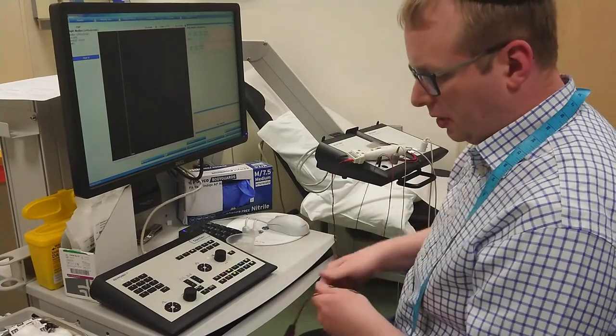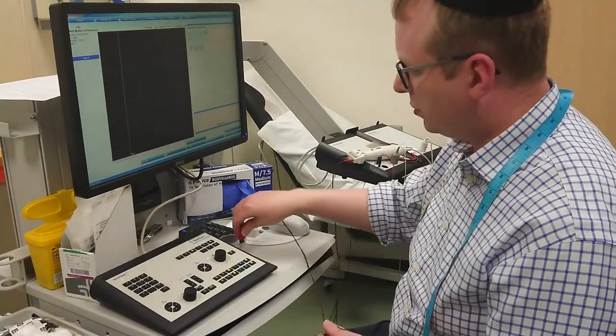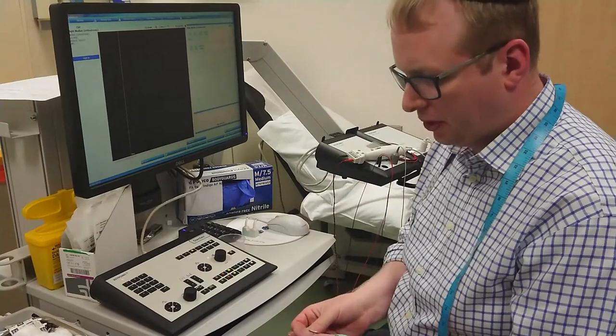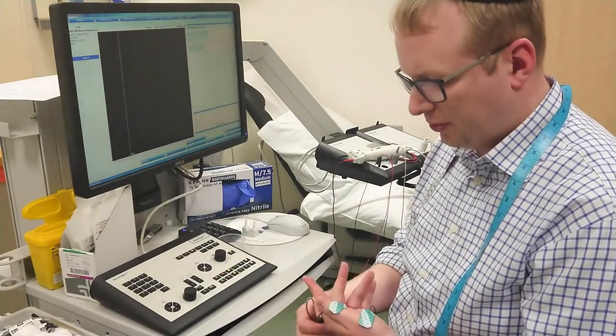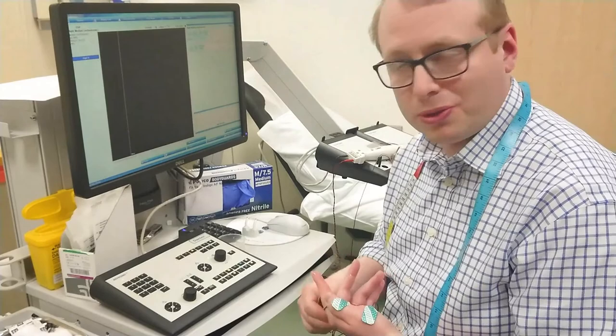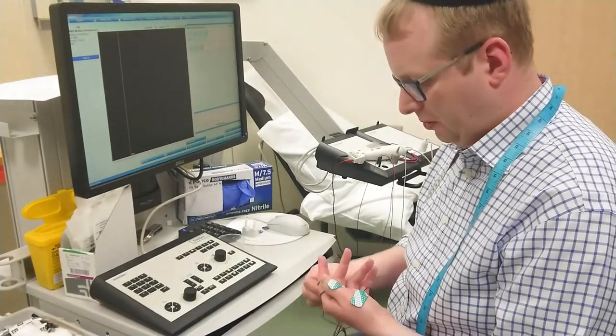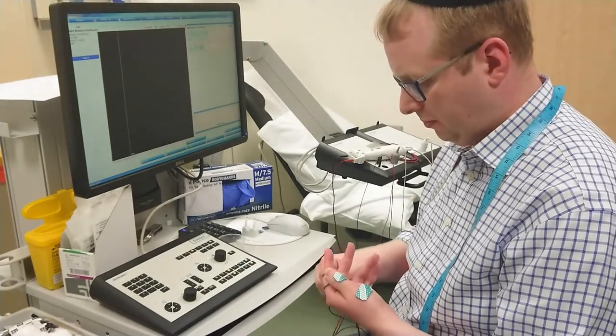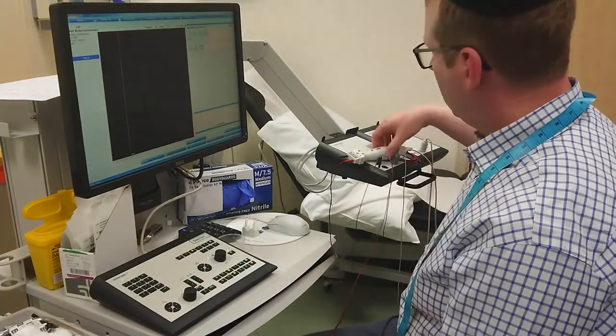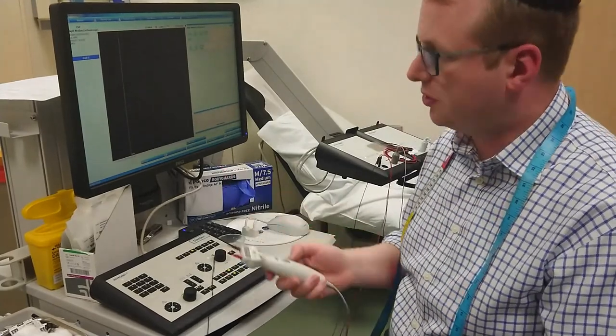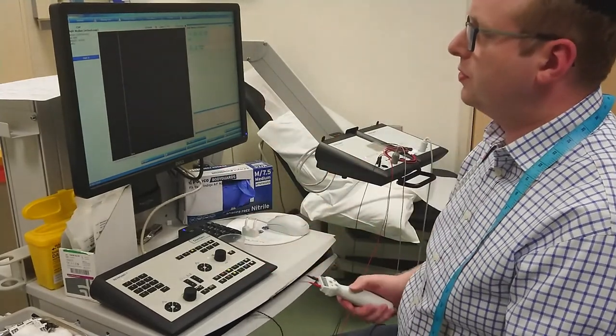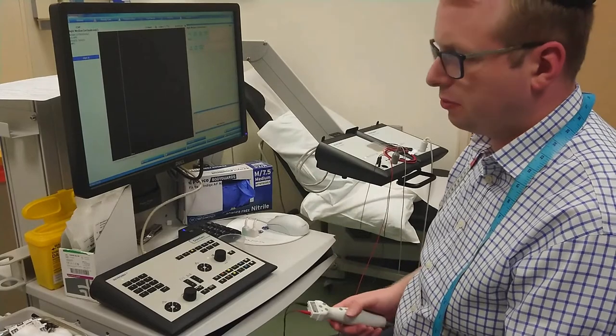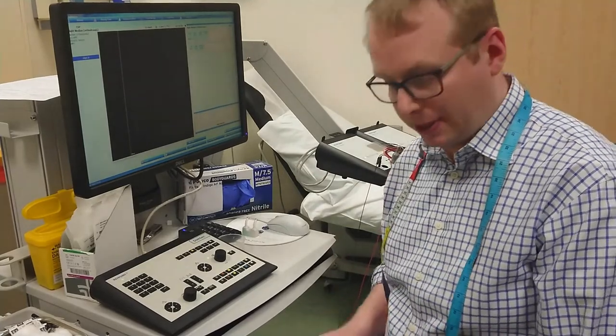And you can see over here I'm using ring electrodes, this will just be a little bit easier for demonstration purposes, given that I'm doing this all myself. And I've hooked them up into the stim trailer and I've increased the current here to 33 milliamps, so that's going to hurt a little bit.